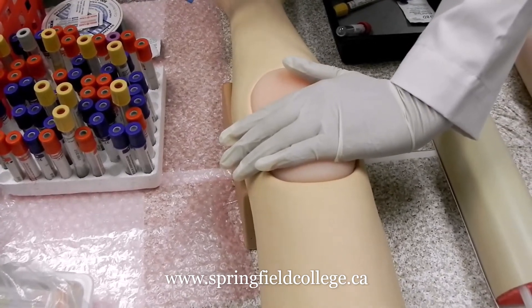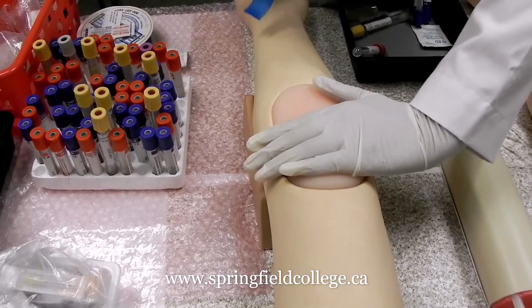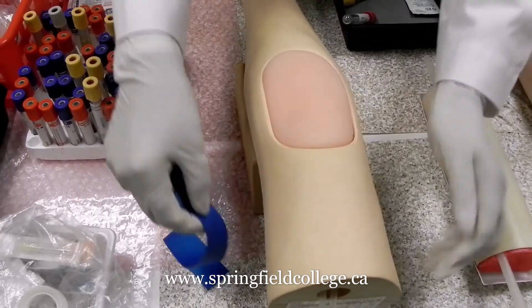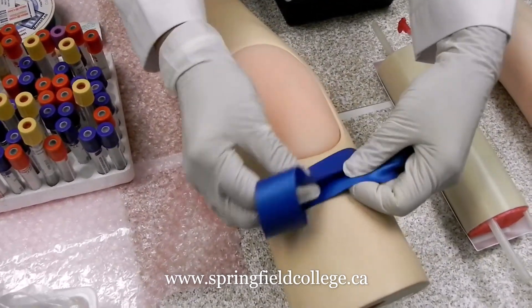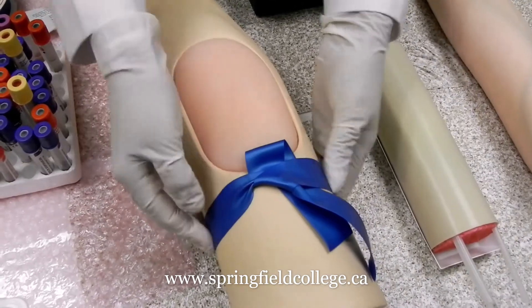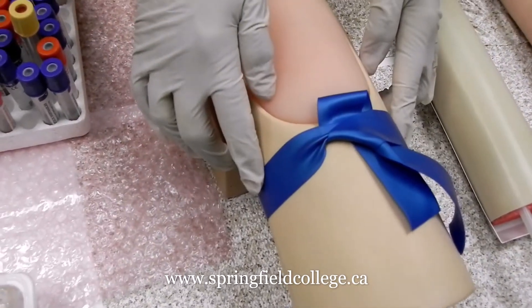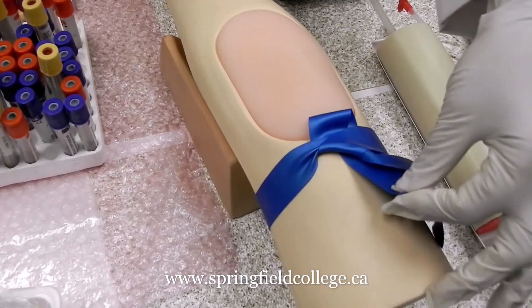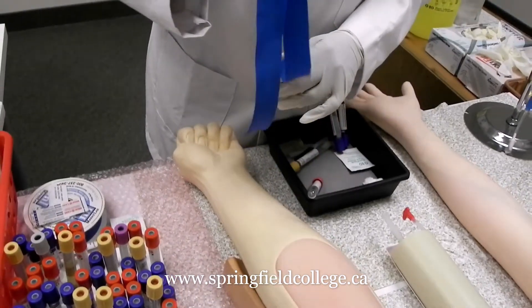Tourniquet application is a very important component of the phlebotomy procedure. Roughly four to five fingers — depending upon the size of the finger — or three to four inches above the cubital fossa, we place our fingers and apply the tourniquet. We make an X and from upside down go for the application, checking that there is no stretching, not too tight, not too loose. Remember to keep it on for no more than one to one and a half minutes. The moment we start collecting blood, we need to remove the tourniquet — from the smaller end it's much easier to remove.